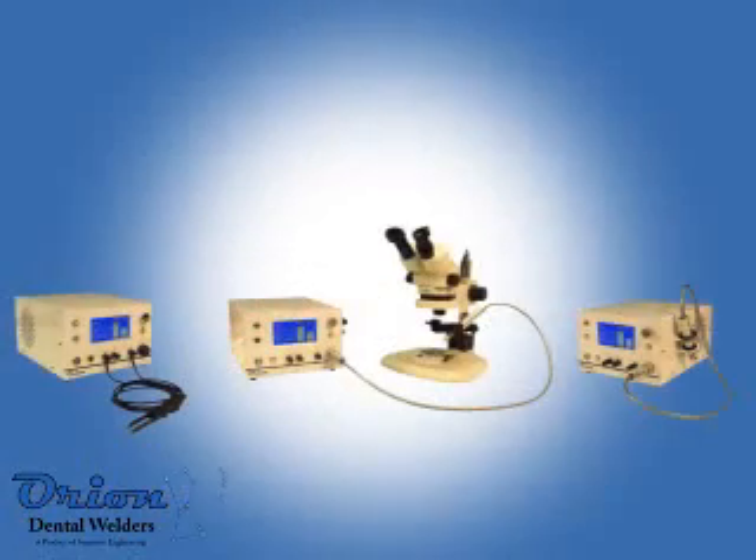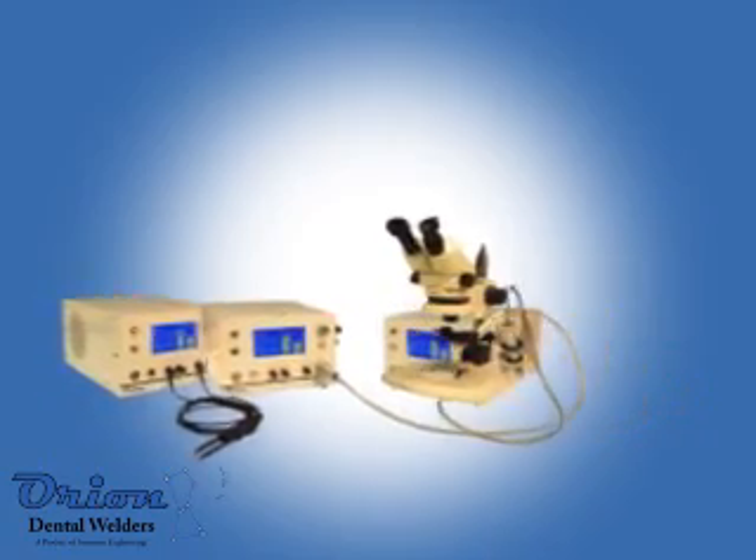The Orion is actually three different welders: a Pulsark Welder, a Micro Pulsark Welder, and a Resistance Spot Welder. All three welders are contained in one space-saving and portable package.